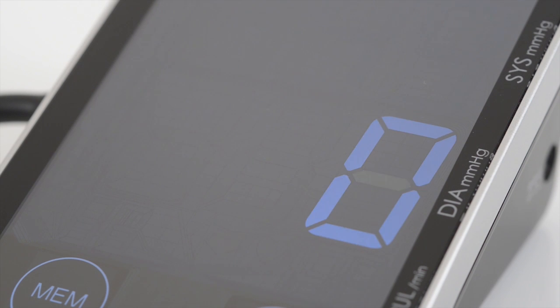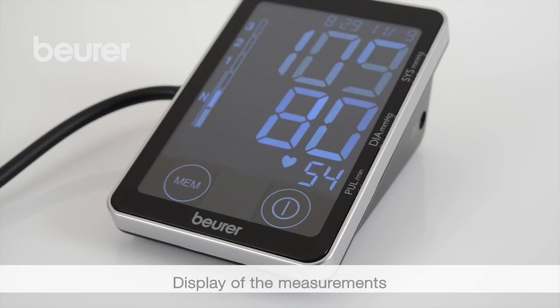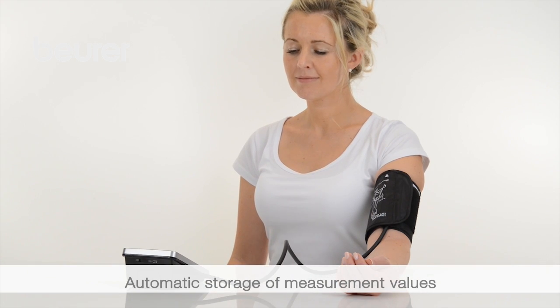The measurement begins. Systolic pressure, diastolic pressure, and pulse measurements are displayed. The measurements are stored automatically.